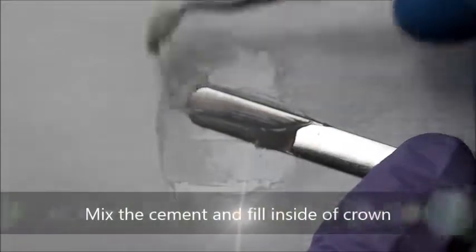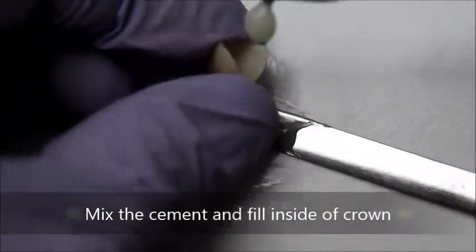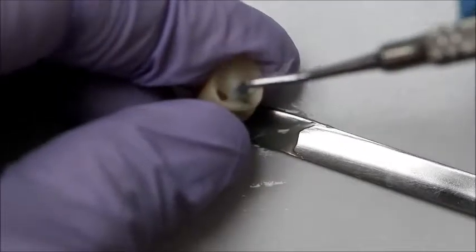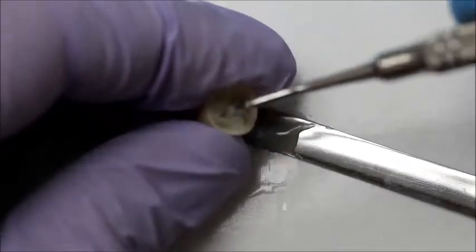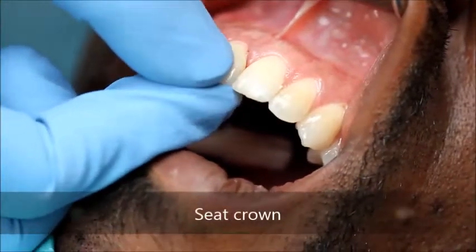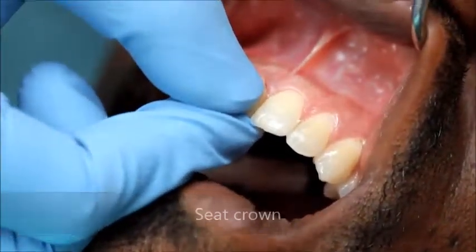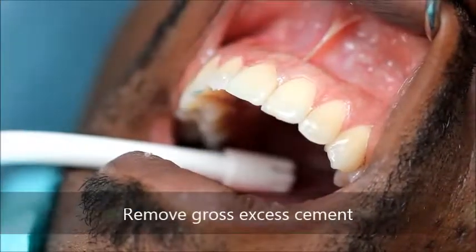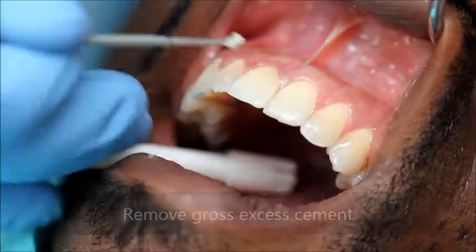A total-etch resin cement is used for bonding. The base and catalyst are mixed and the crown is loaded with cement. The crown is seated and pressure is applied to ensure complete seating. Gross excess cement is then removed gently with a micro brush.